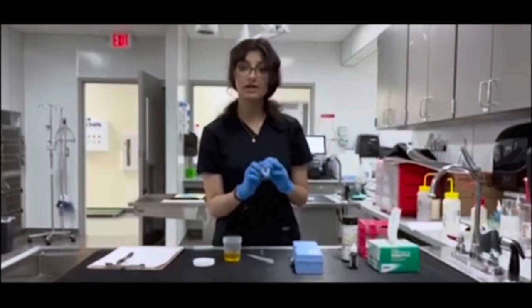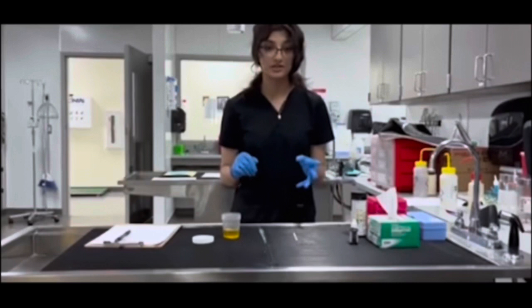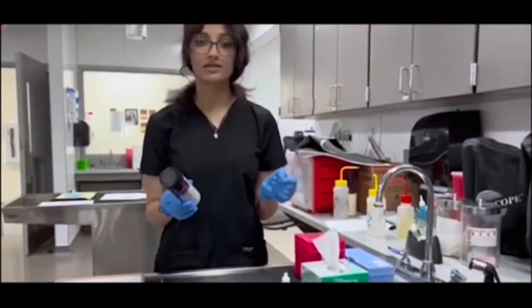Now that we have that done, we are going to move on to the next step and do a urine test strip. You just want to take a urinalysis test strip, take some urine, and put a drop on each one of these colors. Now that we have waited the full two minutes, we are going to take our test strip and compare it to the bottle and record our results.